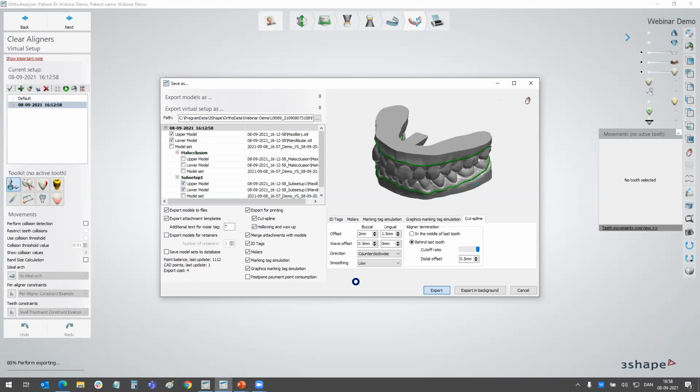So there are some ways that we make sure that the labs can show the treatment vision to doctors, even if they don't use treatment view, without having to pay for the export. So it's fair for everybody. And of course, you don't pay for failed exports and all of that.